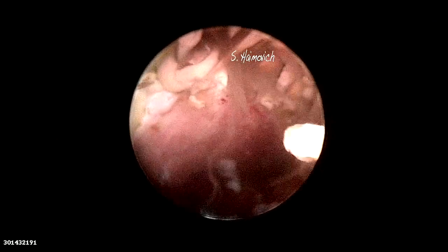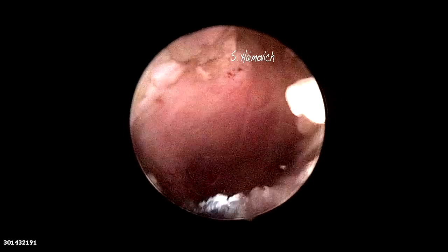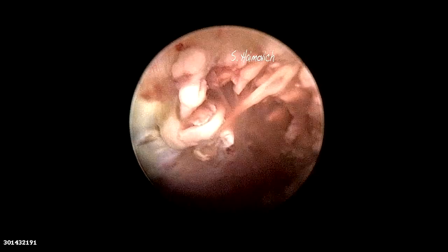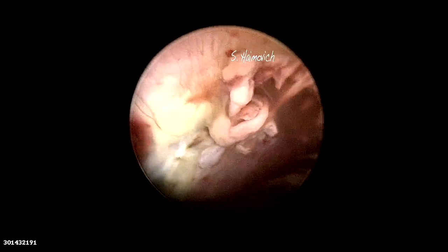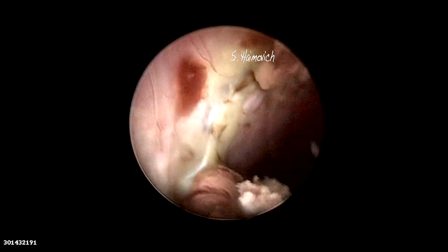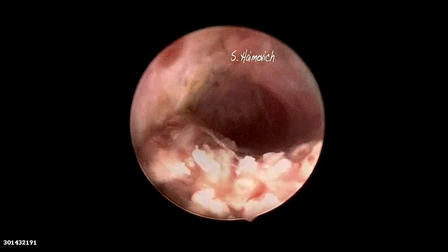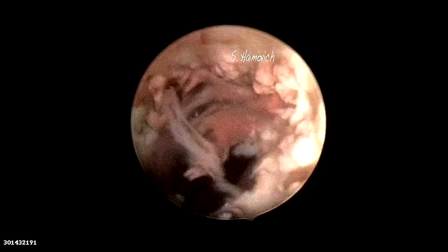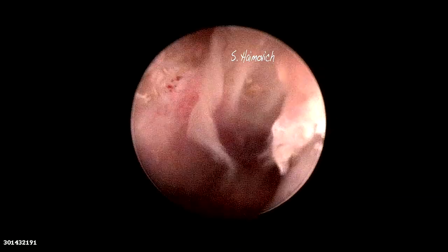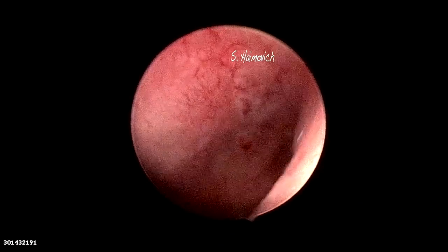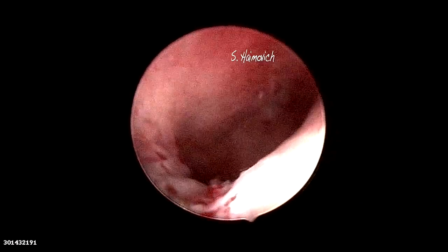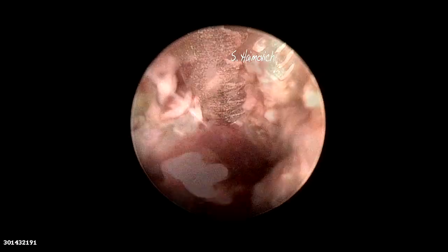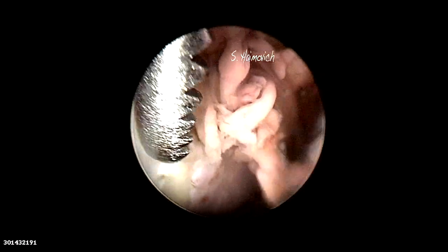Notice the thick brownish discharge in the isthmocele area, together with the active secretion from the glands. We can see also an inflammatory reaction with signs of endometritis covering all the isthmocele area.